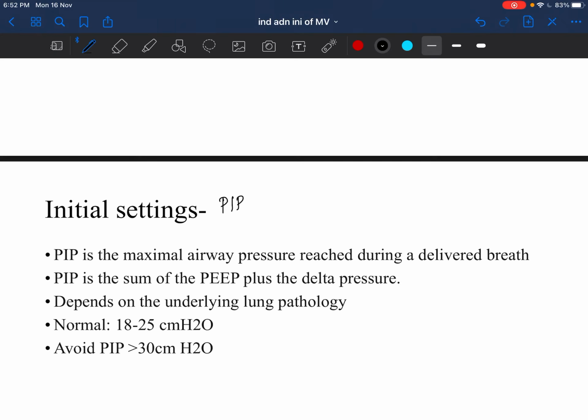You know the waveforms, I do not think I have to teach it again. So, I will just directly go into talking about the waveforms. This is like a standard pressure wave, correct? This part is your PEEP, end expiratory pressure. This is your PIP, am I right?